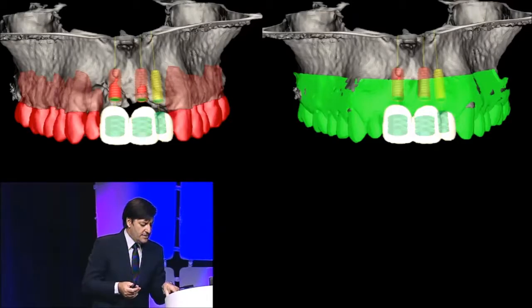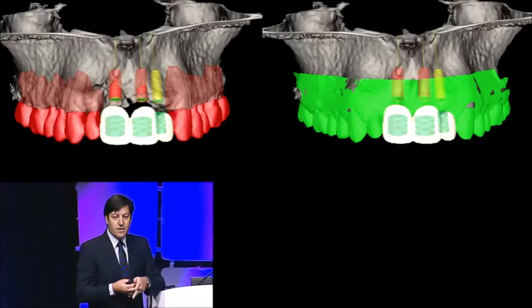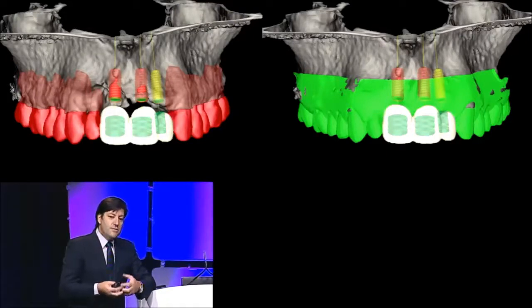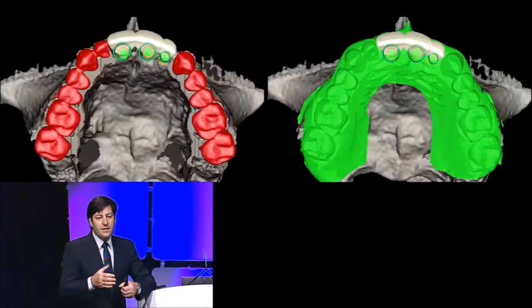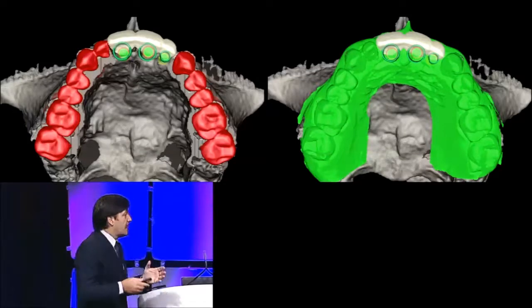Now, I always comment that I placed my first implant in 1994. The only patient at that time who really accepted doing an implant with me was my grandfather. And in order to know the bone, I did a bone mapping. Do you all know what the bone mapping is? We were sectioning the model, then with an endo file, measuring the thickness of the soft tissue to have an idea of what this bone would look like.